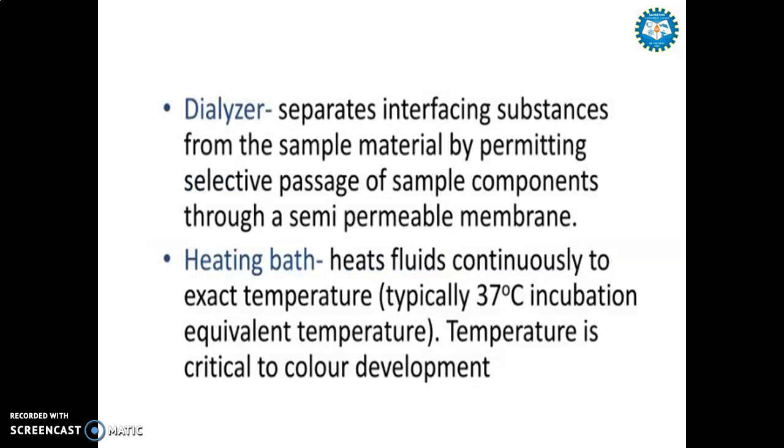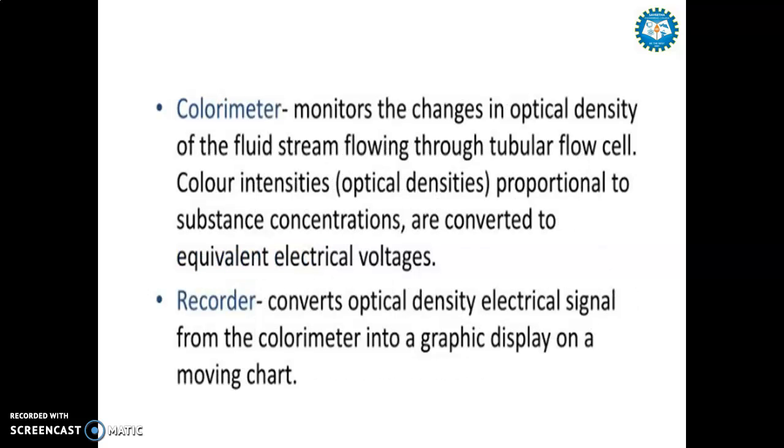The dialyzer separates interfering substances from the sample material by permitting selective passage of sample components through a semi-permeable membrane. The heating part heats the fluid continuously to an exact temperature, typically 37 degrees C, the incubation equivalent temperature. Temperature is crucial to color development.